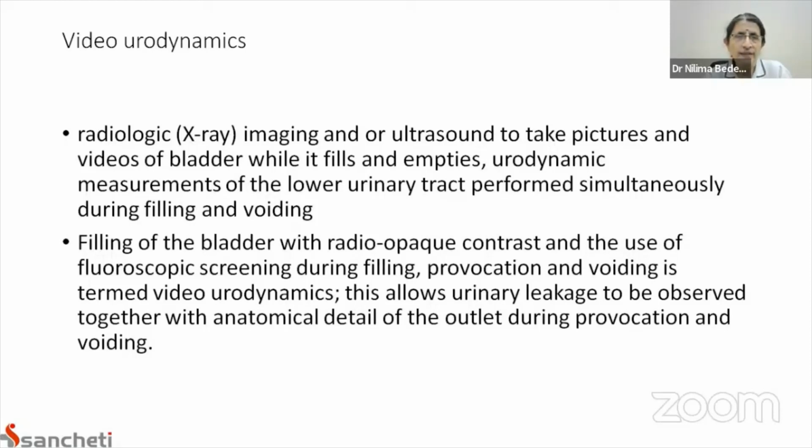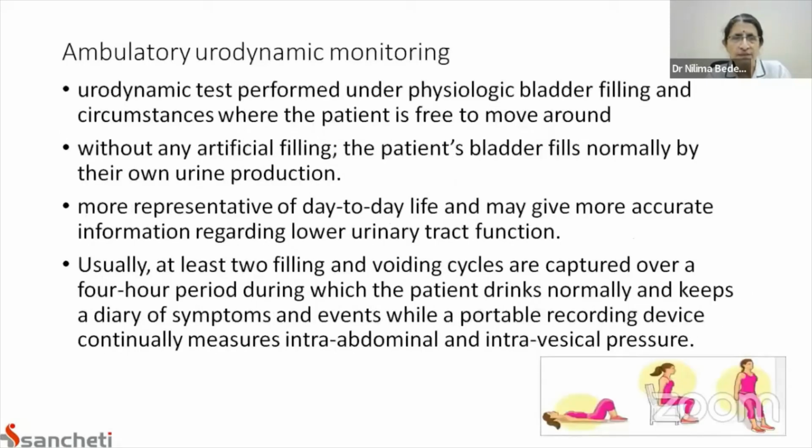This has led to a very special test, which is again very rarely done, but we must know about it: ambulatory urodynamic monitoring. The person does this for about 2, 3, 4 hours and about 2 micturition cycles. It is performed under physiologic bladder filling, where the patient is free to move around without any artificial filling of the bladder.